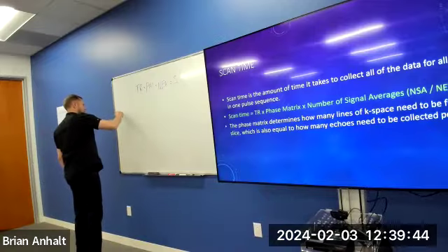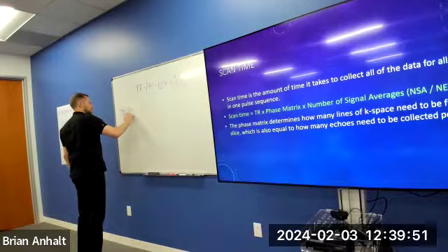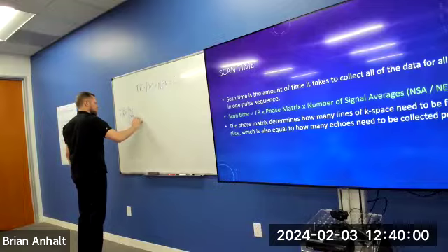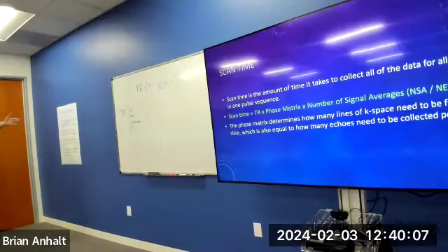So there's four things. If I increase my TR, I get higher scan time. I get higher SNR. I get more slices available. And I get less T1 weighting. You should eventually be able to just pull these out of your brain. Make one change, and this is all the stuff that's happening. So I suggest starting to do that right now.